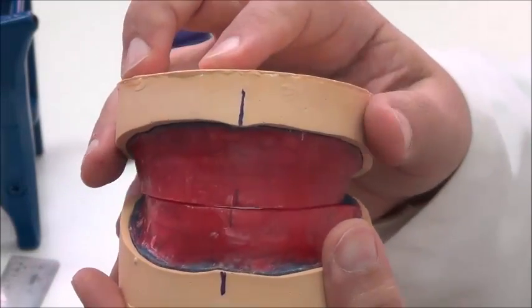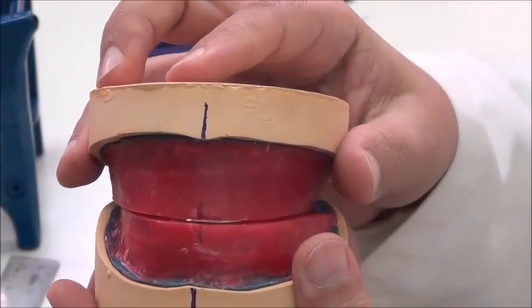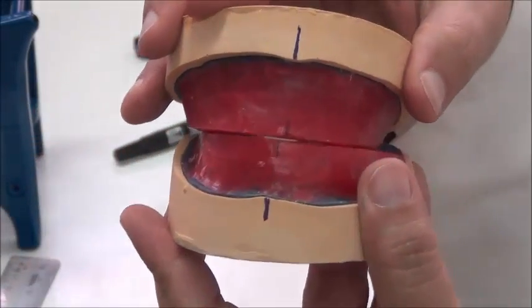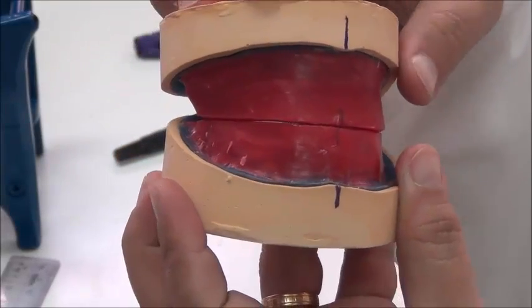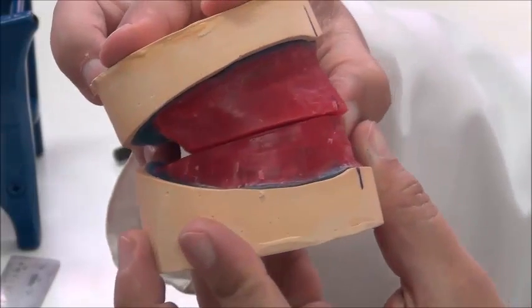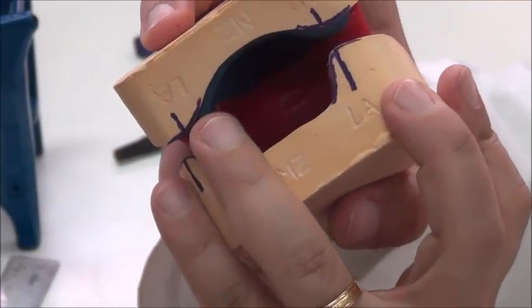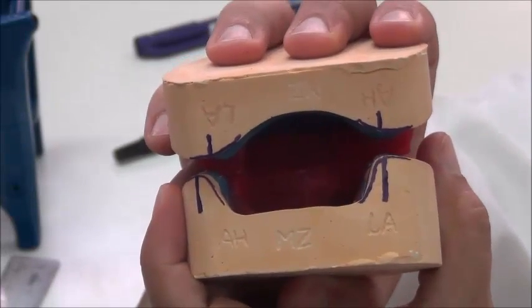But even with this point, I could still go to the left and right, even with these lines coinciding. So I'm also going to use the posterior lines to fix the orientation of the cast together. So the midlines are over each other. Then I'm going to, with an overjet, which is around 2 to 4 millimeters, look from posterior at the wax rims and then compare the posterior lines together.